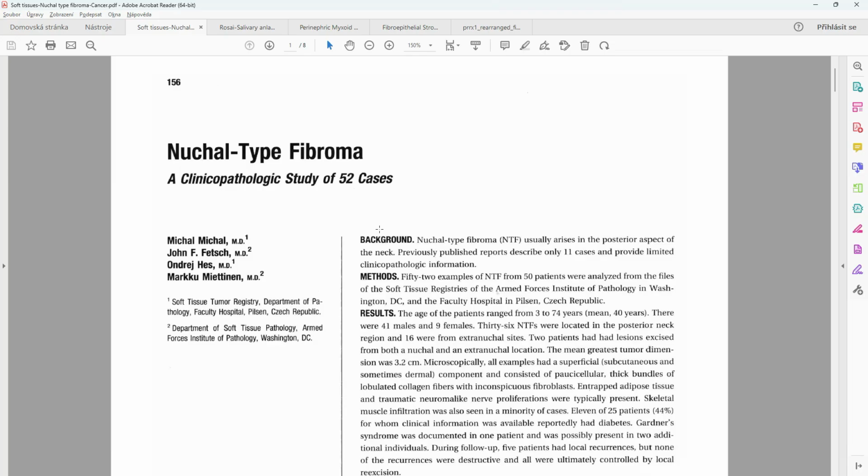It's specific. Yeah, in this patient, we asked the surgeon what is in the large bowel, and he was very surprised that we knew that he's got adenomatosis of the large bowel.